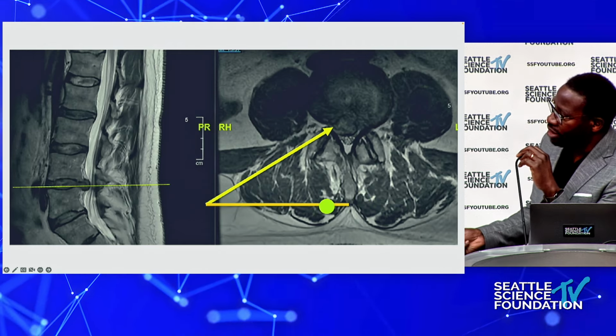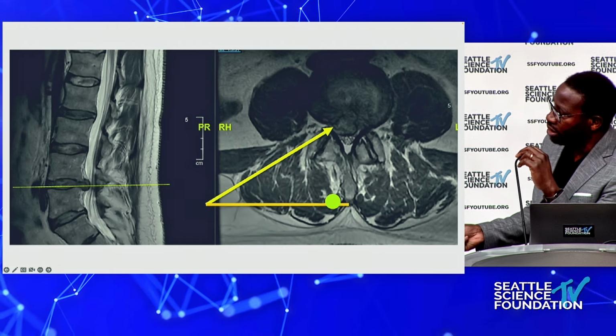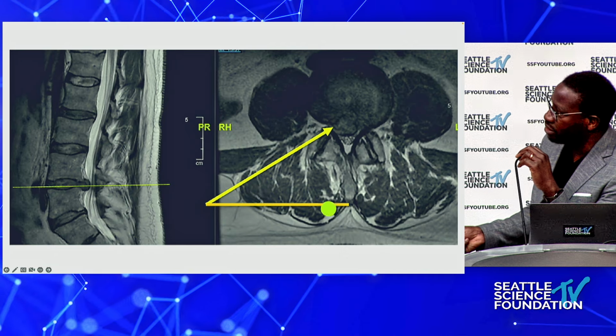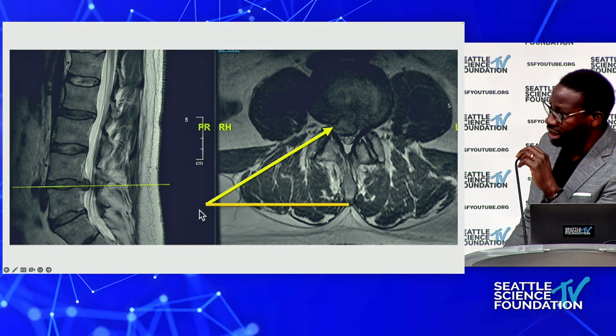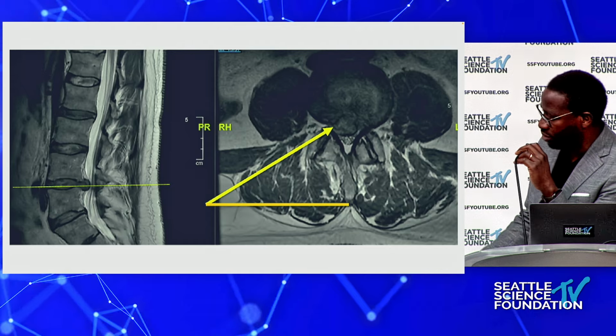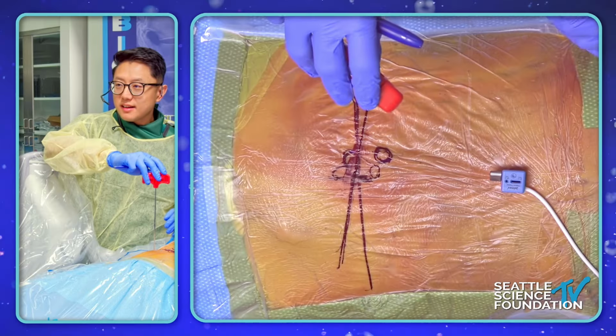And so he's now essentially trying to get his C-arm to be a direct lateral, which is hard for this scoliotic patient. But surprisingly, he is crushing this with very little tools. He's MacGyvering it pretty well. Let's go back to the lab.